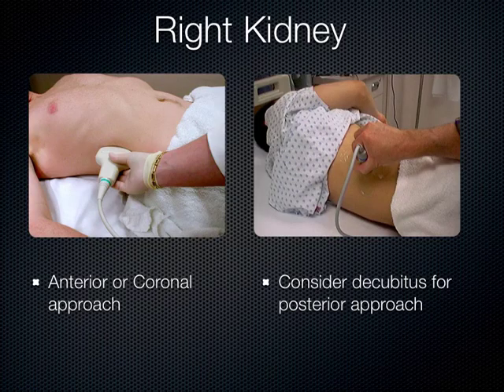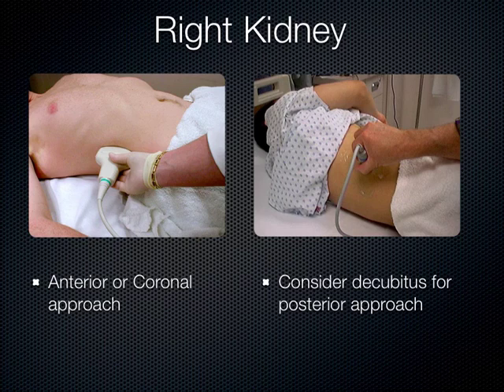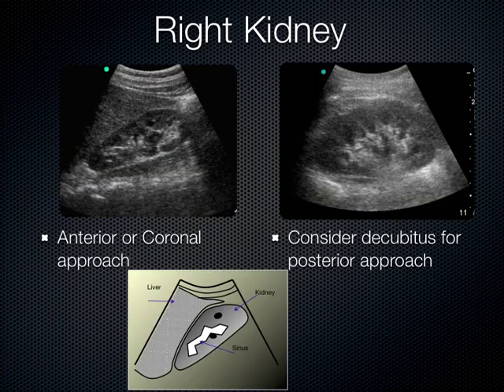How do you actually scan the kidney? You place the probe either in a coronal or anterior location, or turn the probe into a more posterior approach looking between the ribs posteriorly. It all depends on the patient's body habitus — sometimes you get better views coronally, sometimes posteriorly.